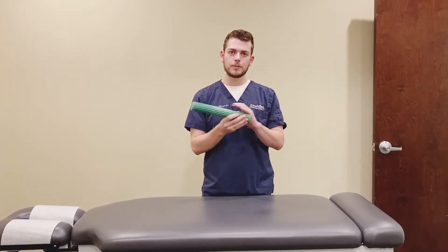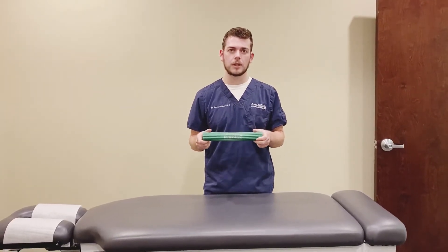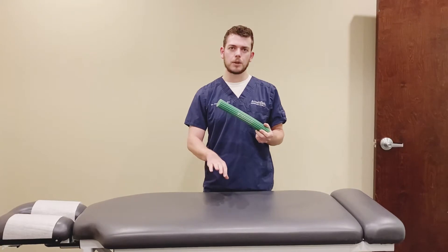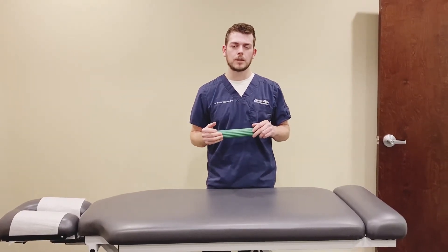I have the TheraBand Flex Bar here today. I've done some other exercises for tennis elbow and golfer's elbow, or lateral epicondylitis and medial epicondylitis, and I'm just going to show some exercises that you can do with this to strengthen your wrist supination and your wrist pronation. This is really good if you have pain or weakness in these areas of your forearm, or you have range of motion issues turning your wrist, or if you're just an athlete like a climber, someone into jiu-jitsu, or CrossFit and you want to work on your strength.